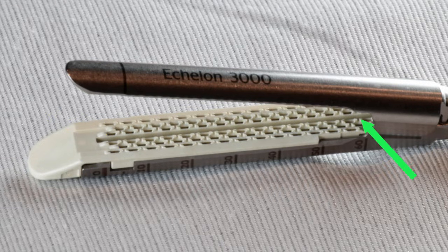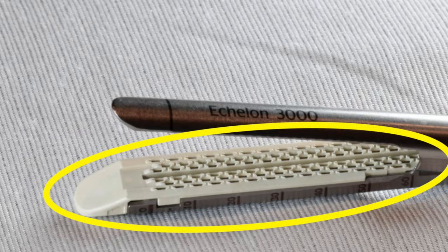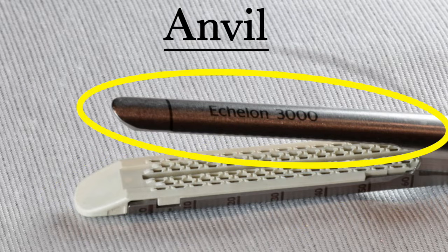And the slot in the middle is where the knife blade comes out and cuts the tissue after it's been sealed. So there are 3 rows of staples on either side of the cut. So staplers have 2 parts. One side where the staples come out, and the other side called the anvil, which is made of metal. And this is where the staples hit, bend, and form to hold the tissue after they've gone through it.